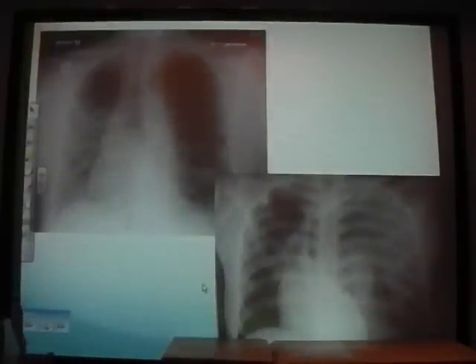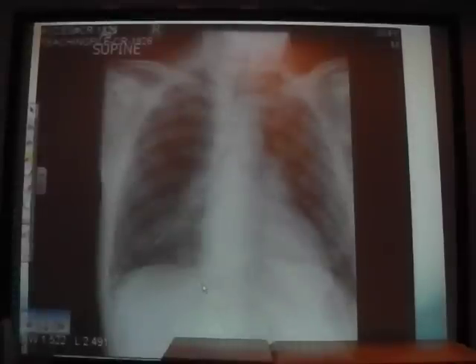Okay. What's going on here really quickly? I think this is the last one. Mediastinal displacement to the right and a big black lung field, so tension pneumothorax. What's happening here? Incorrect placement. Aspiration. Yeah, they've got an incorrect placement of their NG tube. This should never happen, basically. You probably get training on this once you're working, but I think this is it.